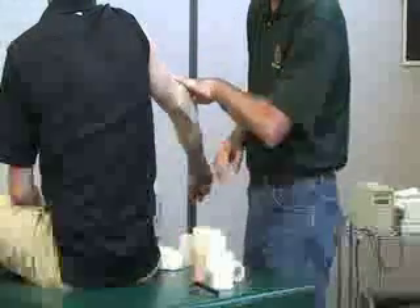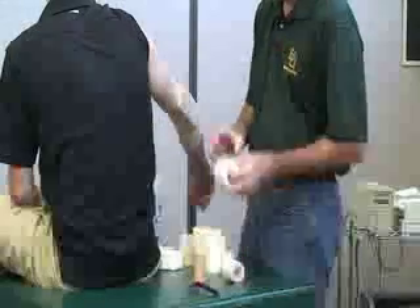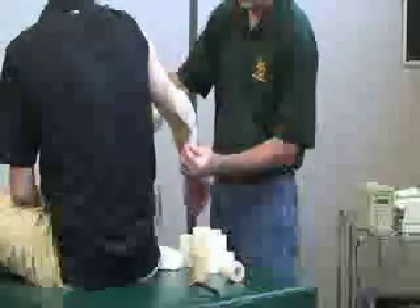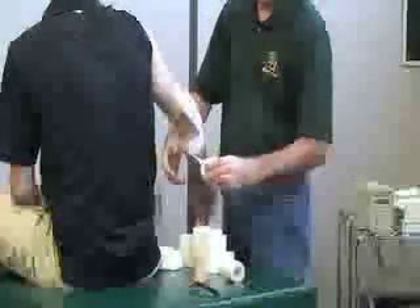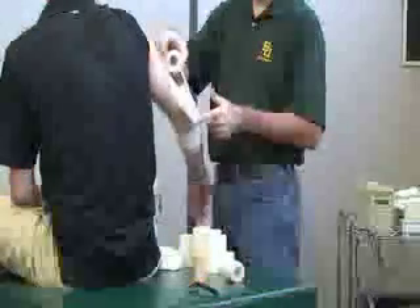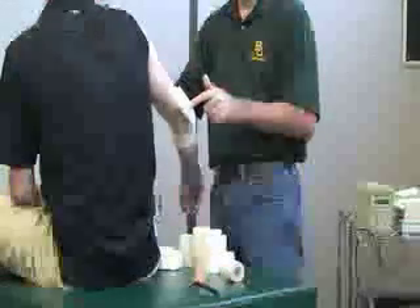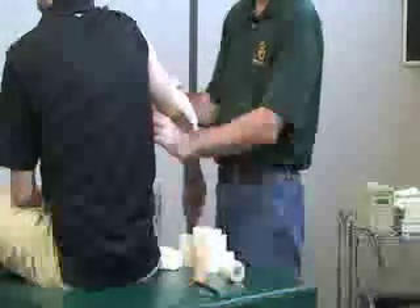Once that's on there, you're going to use your elastic tape. You're going to make the bottom of the eight first, going circular around the circumference of the forearm. Then you're going to come up on the lower posterior, medial part, and cross the elbow joint in the center going diagonal. Then you're going to go to the medial proximal part, going around.